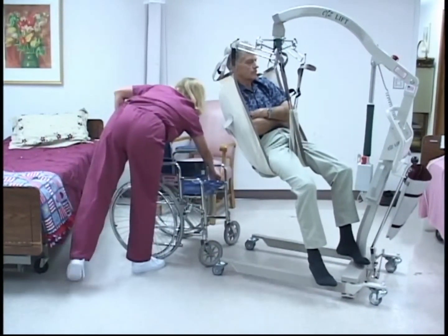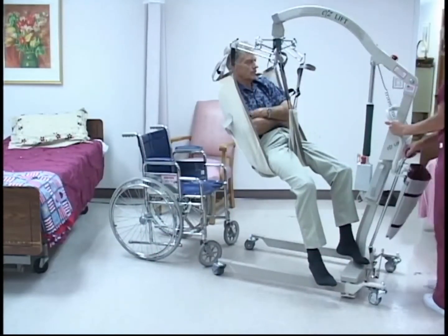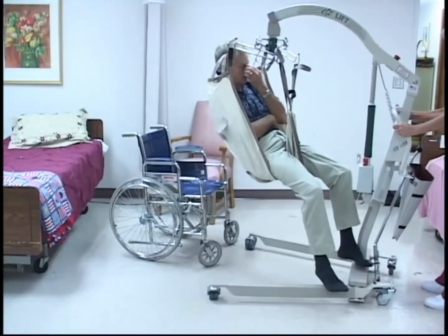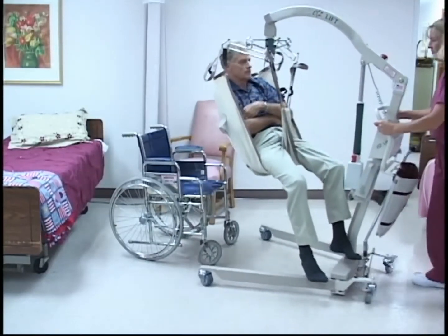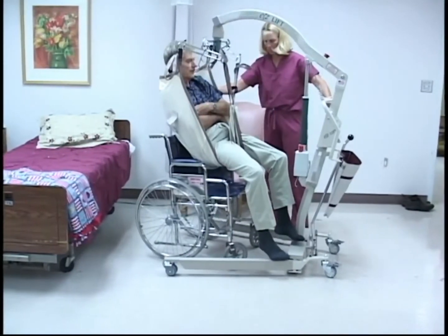With the spreader bar and legs opened, position the wheelchair under the patient. Stand behind the wheelchair and hold both of the side handles on the back of the sling or the middle handle.